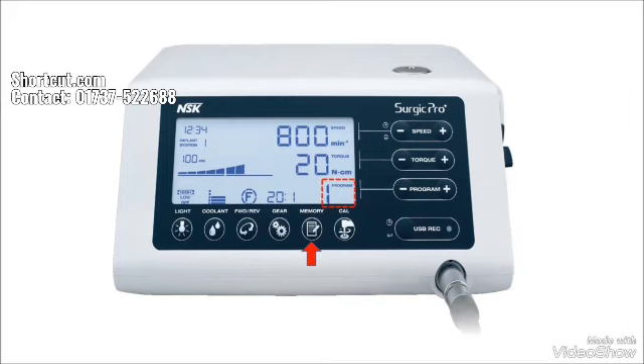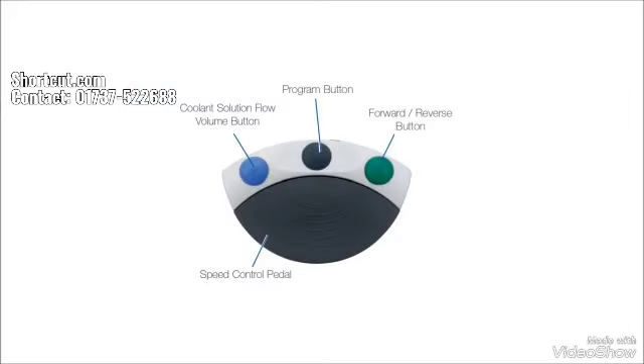Let's talk about the foot control. The foot control has three buttons and one pedal. The coolant flow button, which is blue. The program button, which is black. And the forward or reverse button, which is green. And the speed control pedal.